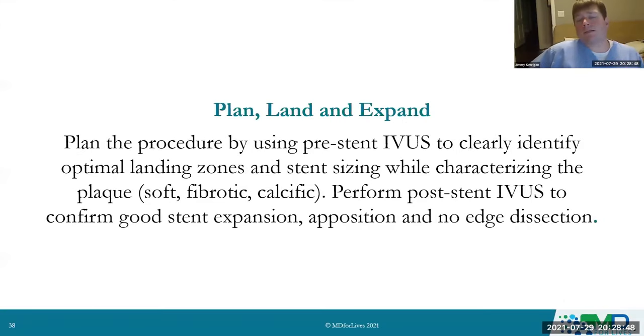So there are several mnemonics that we can use in order to remember how to size the vessel, how to use IVUS, when to use IVUS. I would posit that I use it 99% of the time, not 100, but 99% of the time.